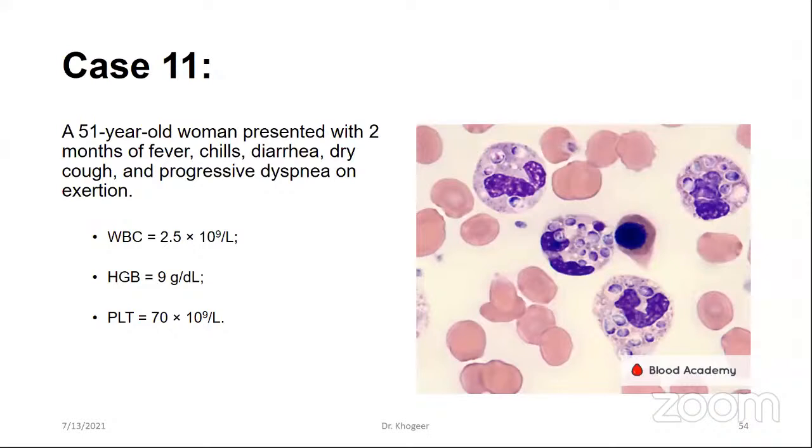Yes, white blood cells are usually normal with absolute lymphopenia in COVID patients. Sometimes in a COVID patient you can see normal white blood cells with normal neutrophils, or sometimes a high number of neutrophils, but the main player in the COVID patient is the lymphocyte, which is reduced. So the absolute lymphopenia can be masked by an increase in the other white blood cell subtypes, like neutrophils and monocytes.